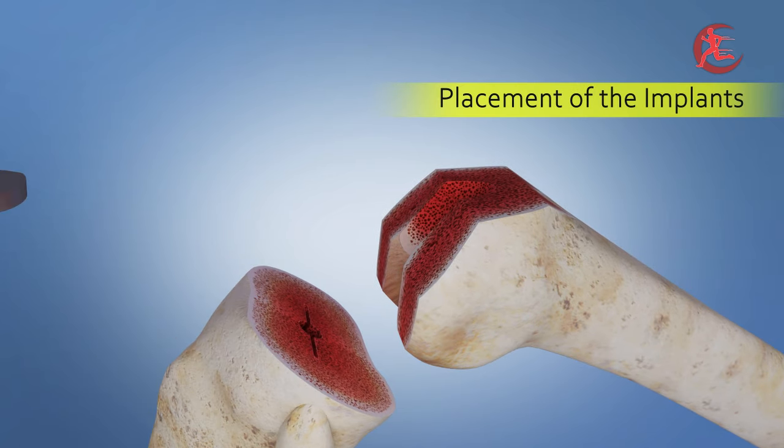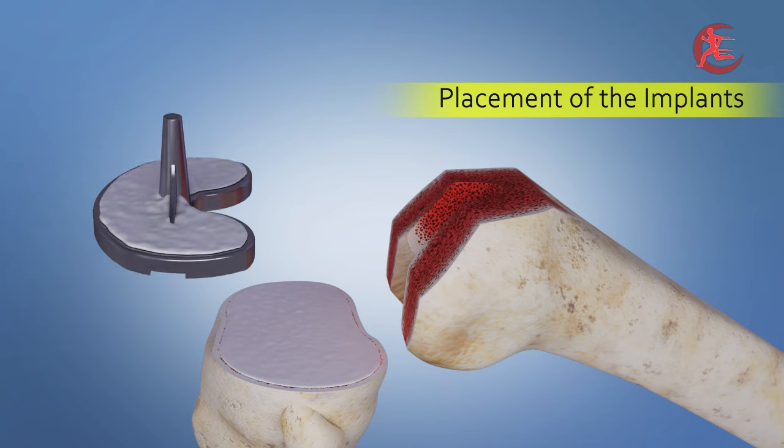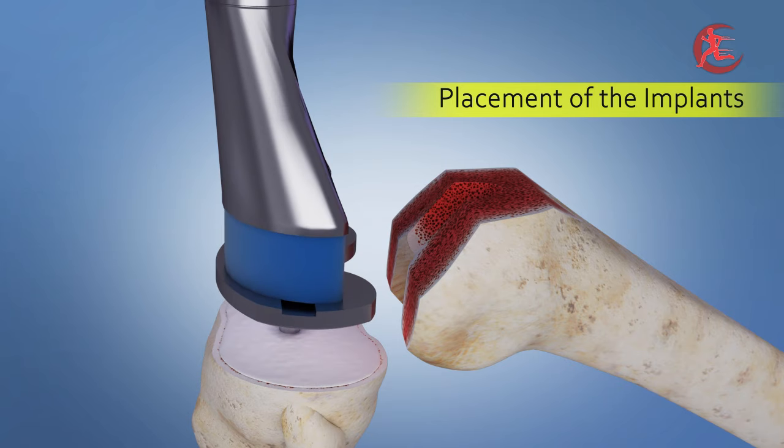To ensure secure fixation, your surgeon skillfully applies bone cement to the backs of the tibia, femur, and patella implants.